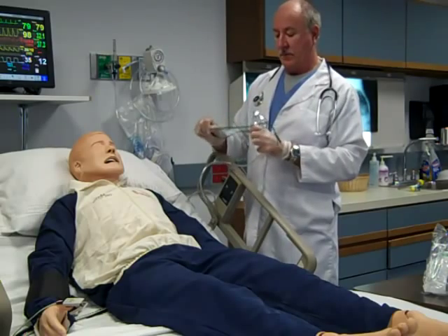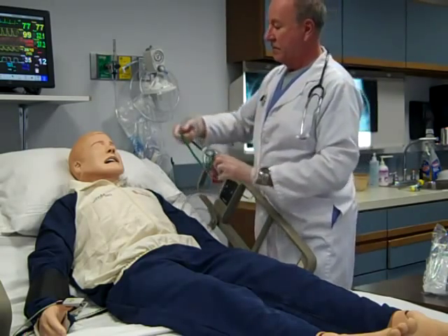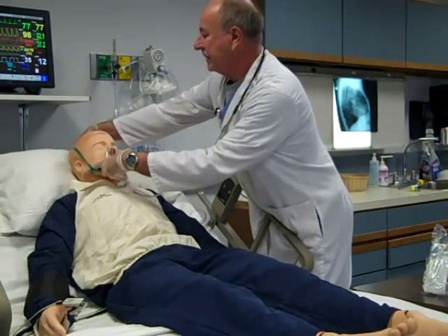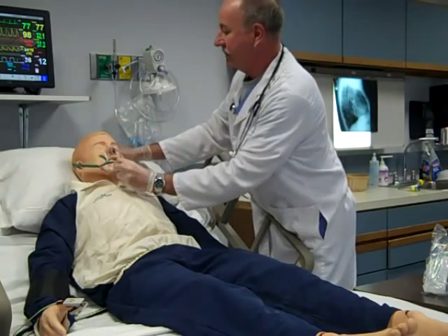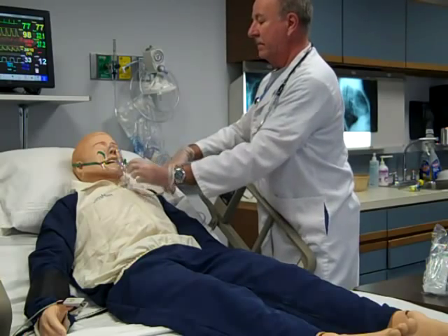Place the simple mask over the patient's face, ensuring a proper and comfortable fit. The mask should be positioned over the bridge of the nose with the metal band adjusted to conform to the patient, and the bottom curve of the mask under the chin.